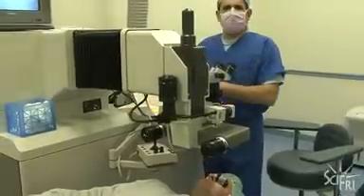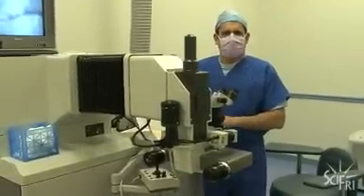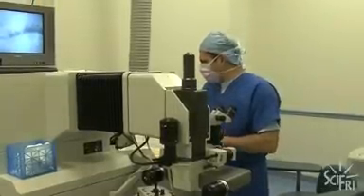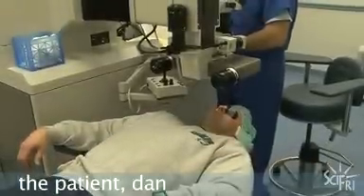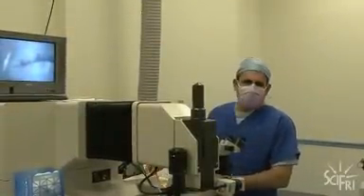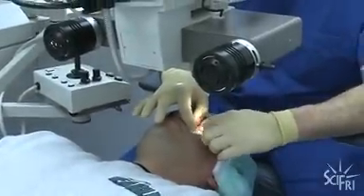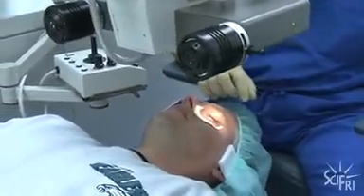But before we can go zapping corneas, Dr. Vale has to prepare the patient. Hi, it's Dr. Vale again. We're here in the operating room with our patient Dan. Dan's already been pre-medicated, and he should be pretty relaxed, but if he's not, we'll deal with it. Patients are not put to sleep for LASIK surgery. We need them to fixate on the fixation light so that the laser can fire. And we do have a tracking system for the laser, but if the eyes couldn't look up at the laser, there's only so far the laser would track.